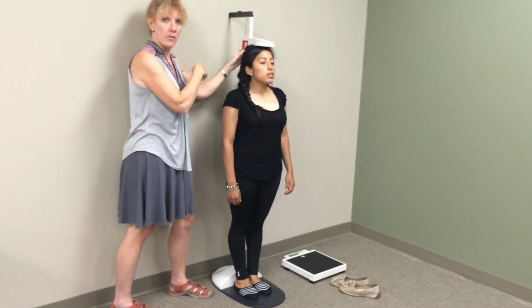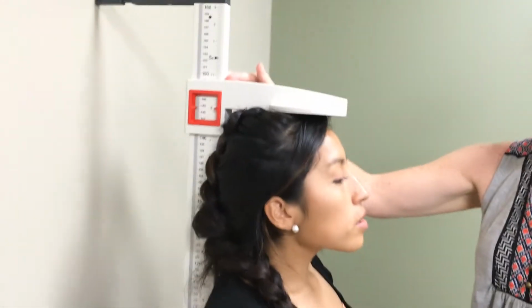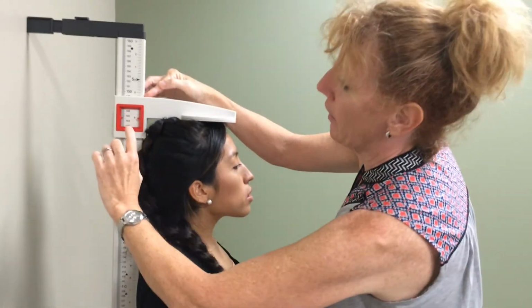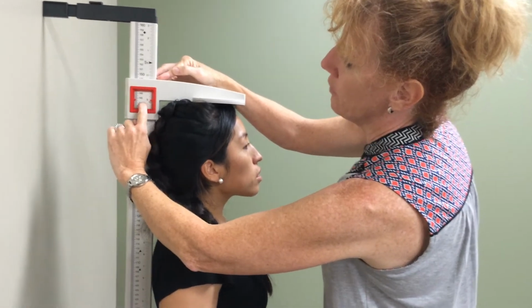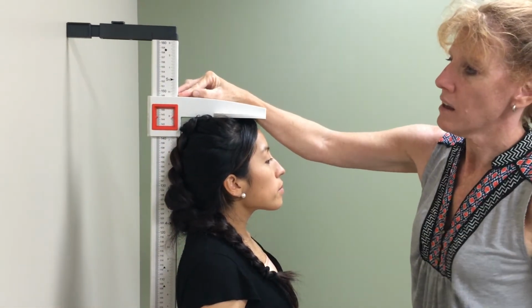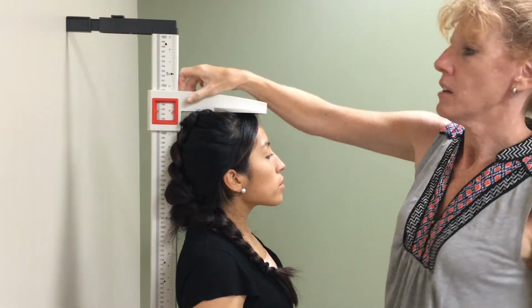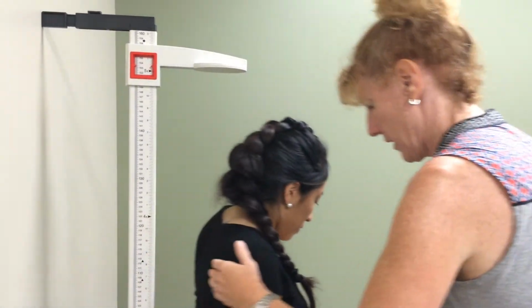You probably want to come over. Here is where you do the measurement. You actually record whatever is between these two red lines. So in this case, I would call this 144.5 centimeters. You release it, you say, please step out.